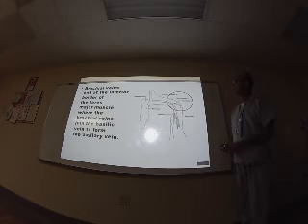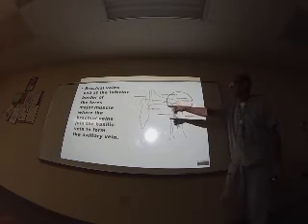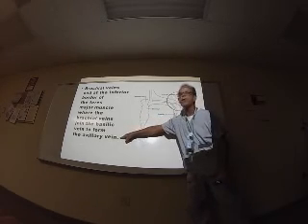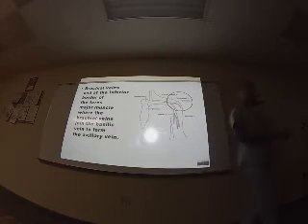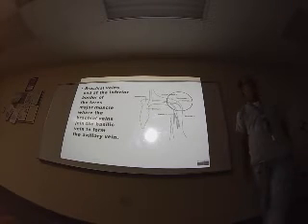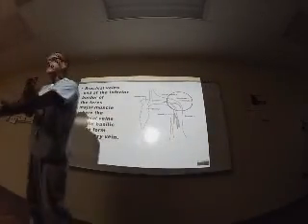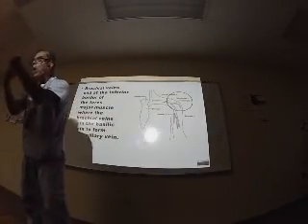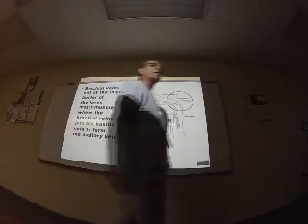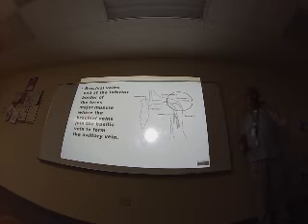Brachial veins end at the inferior border of the teres major muscle, where the brachial vein joins the basilic vein to form the axillary vein. We are not talking about the axillary artery. In the same place where the axillary artery is, the axillary vein is also. You want to know what is the difference? Put pressure with the transducer, the vein closes, the artery remains open. This is the easy way to know whether something is a vein or an artery.